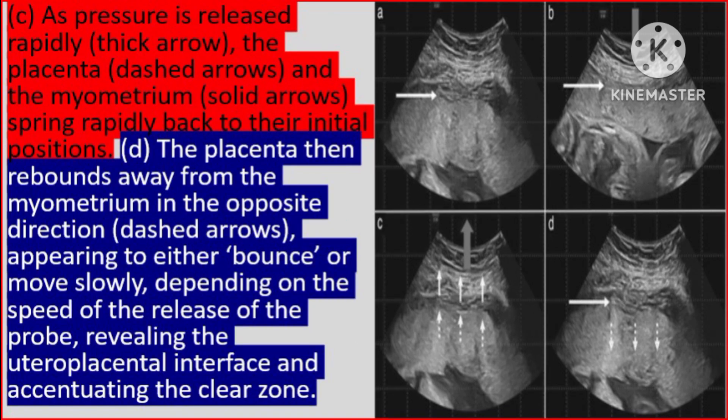C: As pressure is released rapidly, the placenta and the myometrium spring rapidly back to their initial positions. D: The placenta then rebounds away from the myometrium in the opposite direction, appearing to either bounce or move slowly, depending on the speed of release of the probe, revealing the uteroplacental interface and accentuating the clear zone.